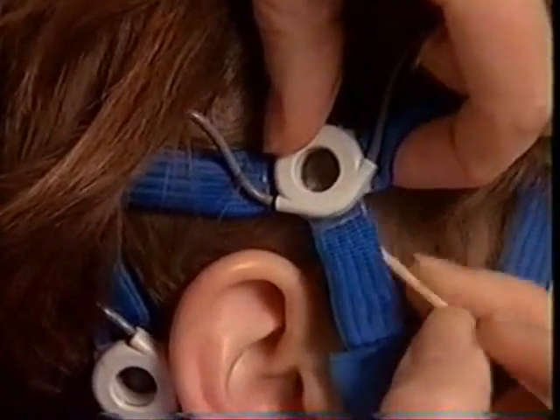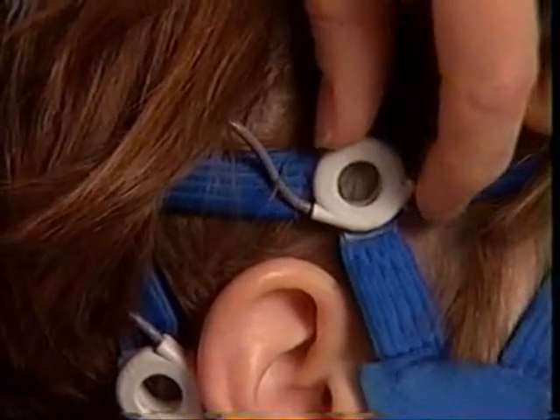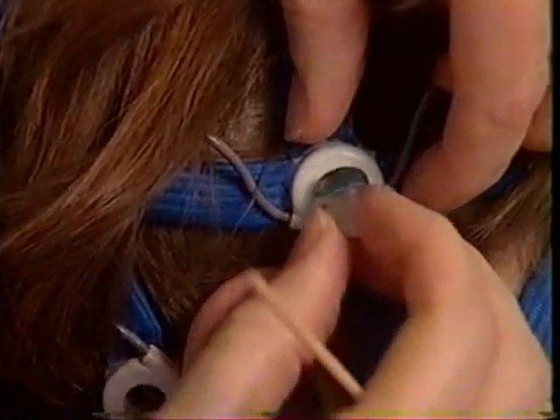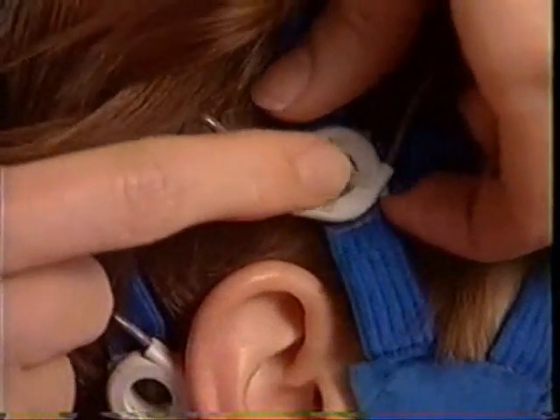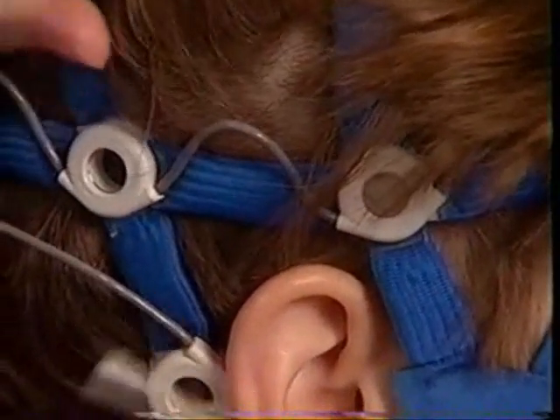Tilt the sockets slightly, prep the scalp, sweep the hair away, tilt the socket and insert a biosensor. Press slightly to assure good contact. Repeat this procedure for each biosensor around the circumference.